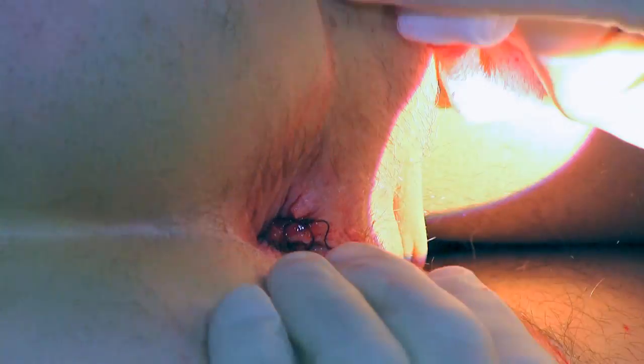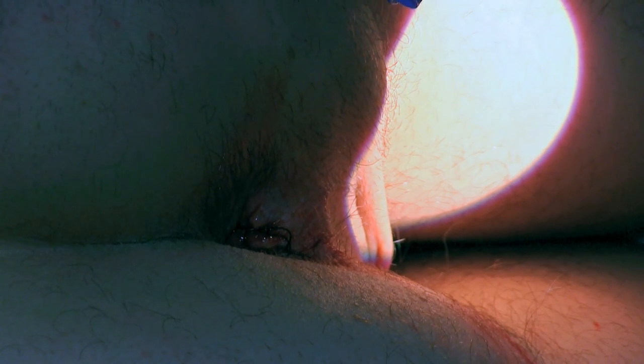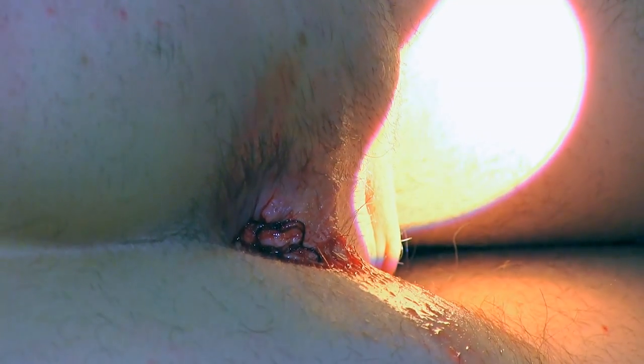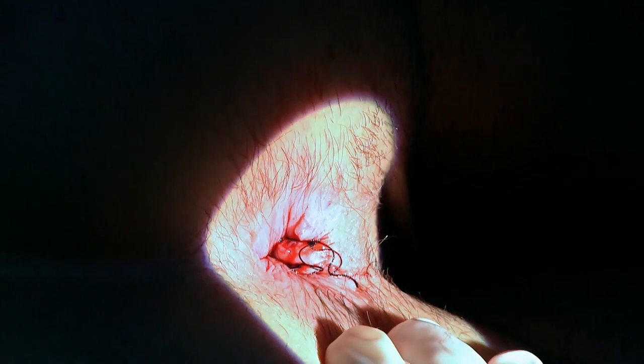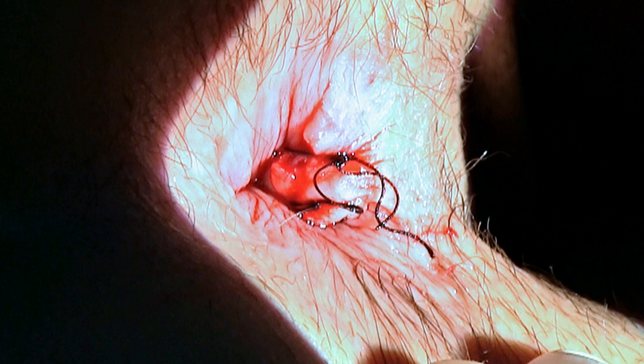Could I have some more antiseptic please? I'll just tidy that area up with some antiseptic and then take a photograph to demonstrate we've got a nice couple of good sutures in there. And there you've got it — nicely tidied up. Let's see the suture in there.